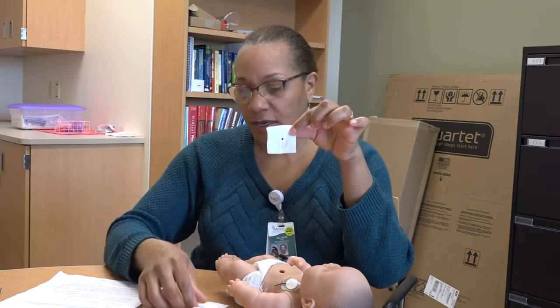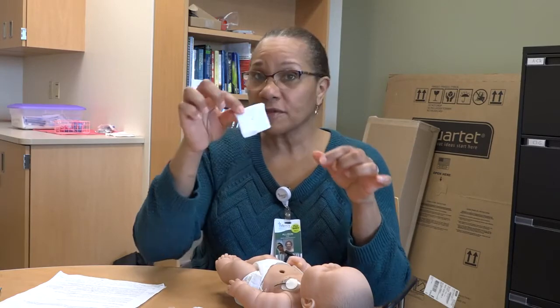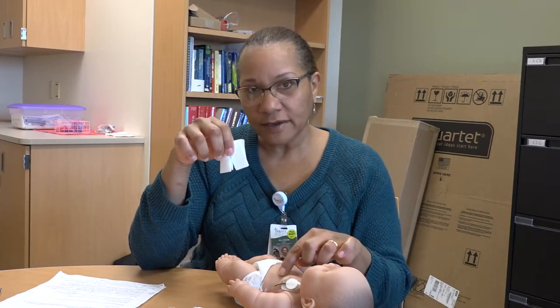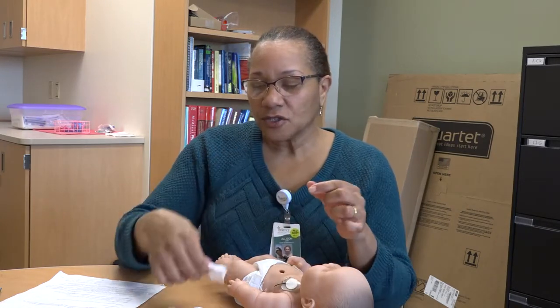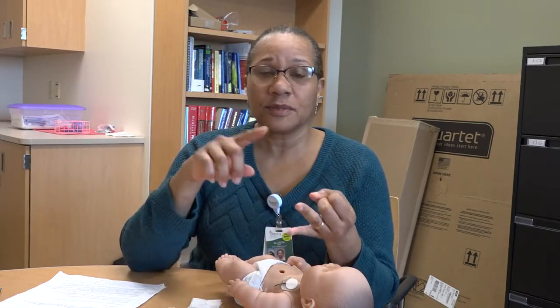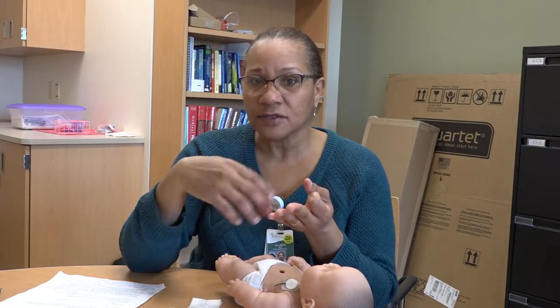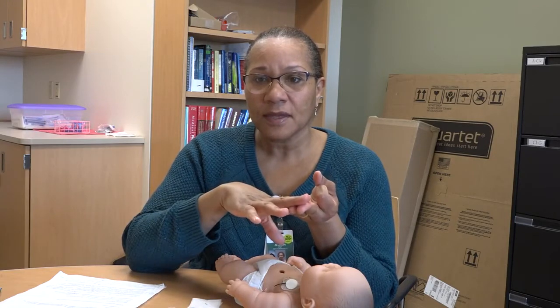This is a split 2x2. They come two in a package, so you can use both of them together, or you can use just one. It depends in this post-operative period on how much swelling there is in the area and how many will fit underneath that site. After surgery, you're going to expect redness, swelling, and drainage, because during the healing process there's going to be some fluid that comes from that area.